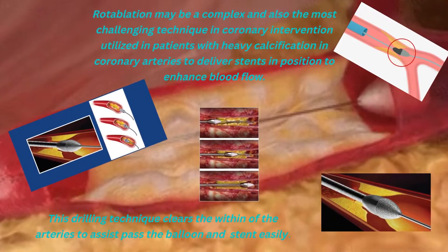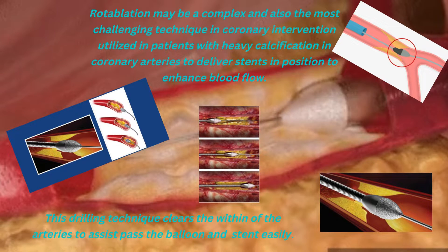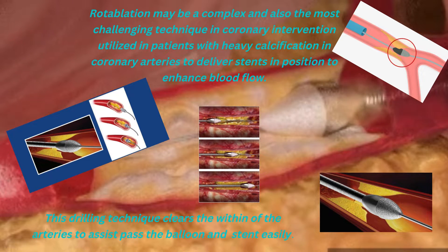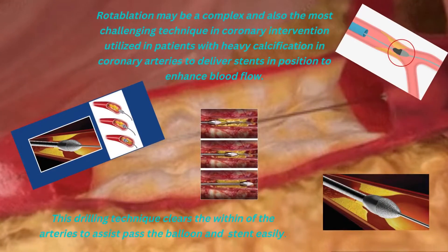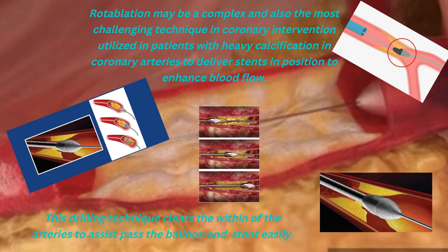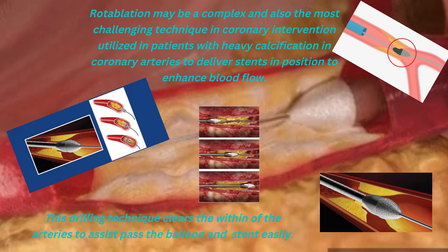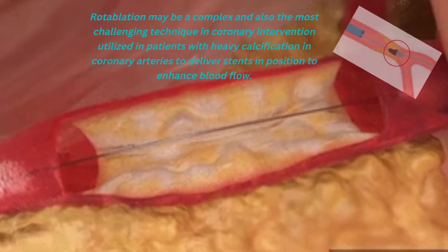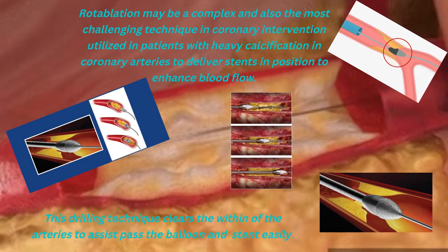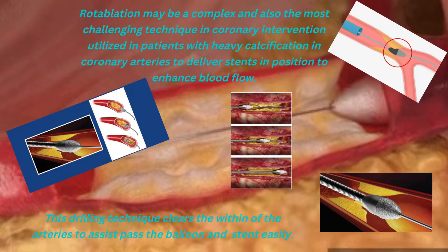The last procedure is rotoblation, also known as rotational atherectomy — a complex and challenging technique in coronary intervention. It is utilized in patients with heavy calcification in coronary arteries to deliver stents and enhance blood flow. It is essentially a drilling technique using a special diamond-tip burr that rotates at speeds of 150,000 to 200,000 rotations per minute. This drilling clears the artery, allowing the balloon and stent to pass easily. The catheters used in this method are bigger than conventional catheters.